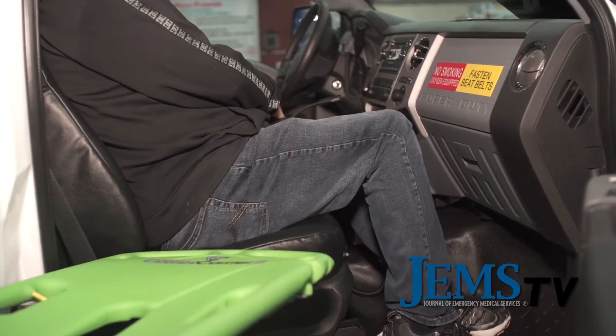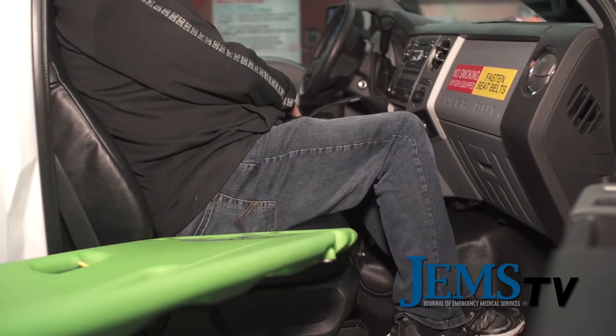Tell me some of the details about the device that make it unique. Well, the Combi Carrier is basically a two-in-one device — there's nothing else on the market like it. It serves as both a scoop stretcher and a backboard, so it can still be used for auto extrication, but it can also scoop somebody off the ground and minimize the amount of movement of that patient before they're placed onto the cot.